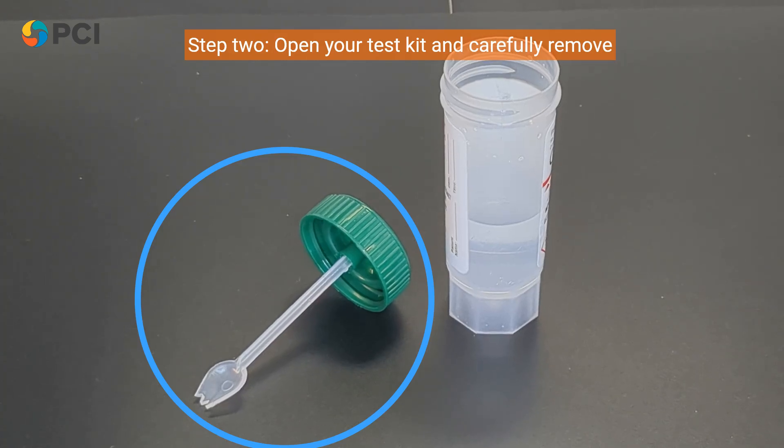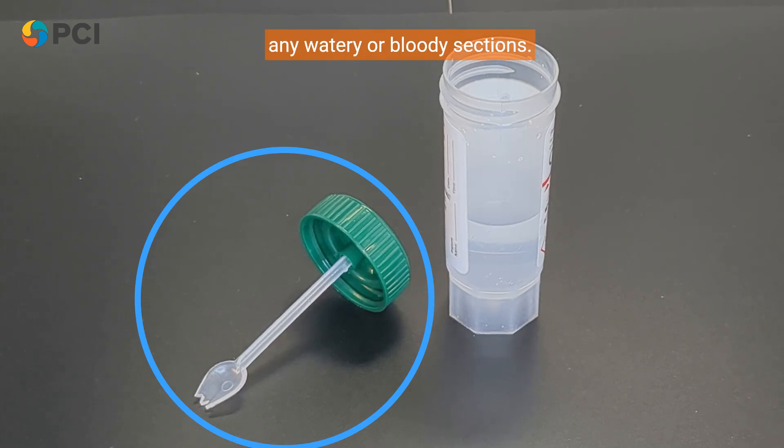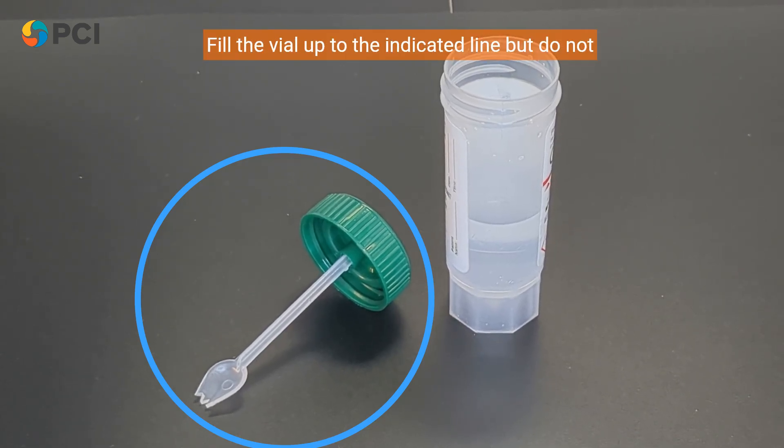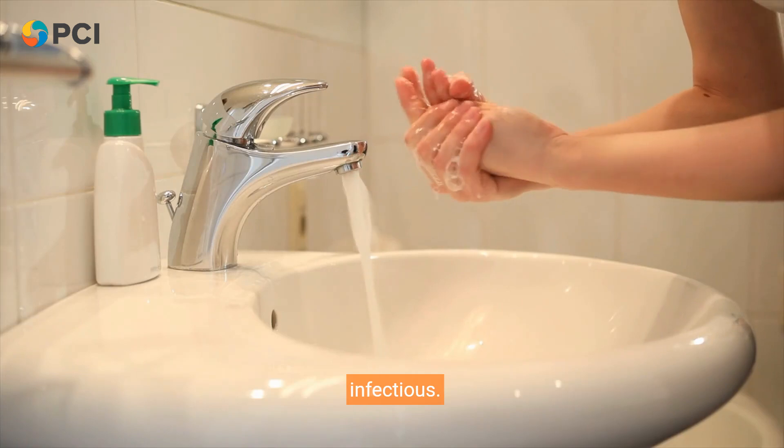Step 2. Open your test kit and carefully remove one vial. Using the spoon attached to the cap, collect small amounts of stool from different areas, especially any watery or bloody sections. Fill the vial up to the indicated line but do not overfill. Always handle specimens with care, as they can be infectious.